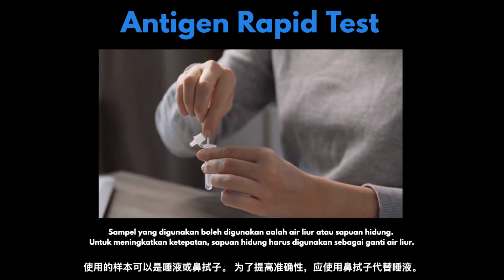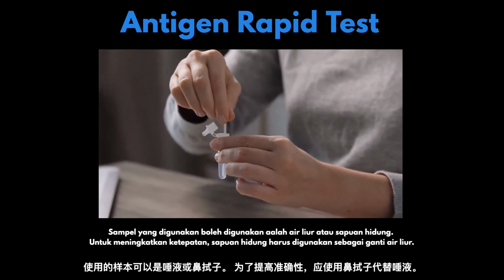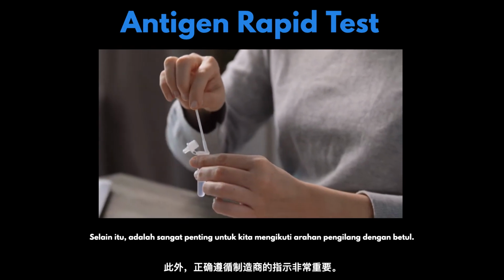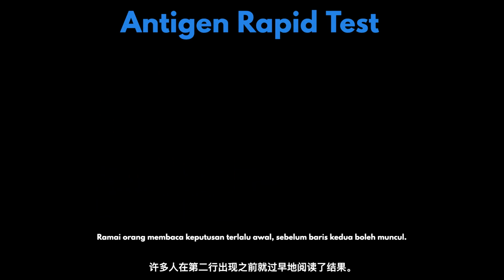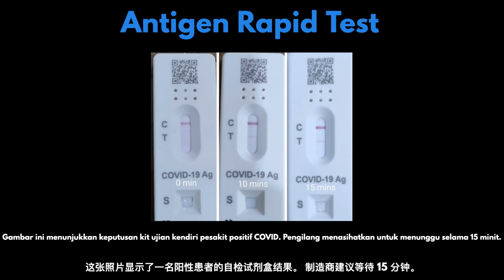The sample used can be saliva or nasal swab. To increase accuracy, nasal swab should be used instead of saliva. Besides, it is very important that we follow the instruction of the manufacturer properly. Many people read the results too early, before the second line could appear. This photo shows the self-test kit results of a COVID-positive patient. The manufacturer advises to wait for a duration of 15 minutes.